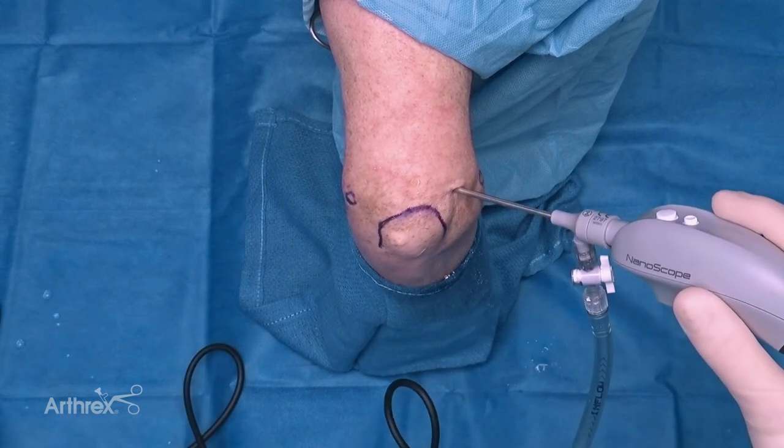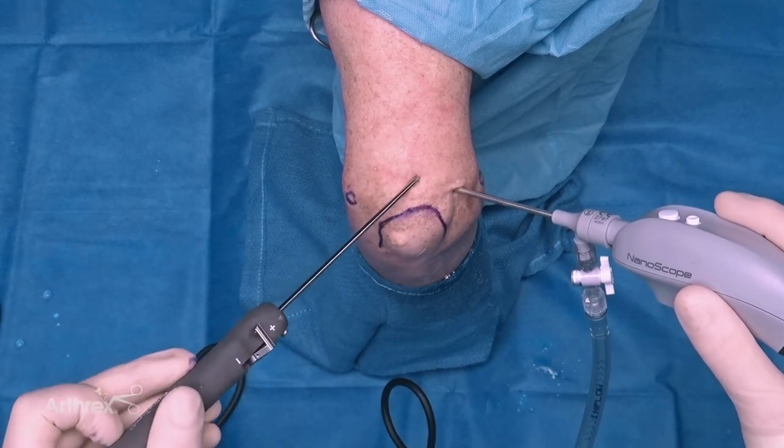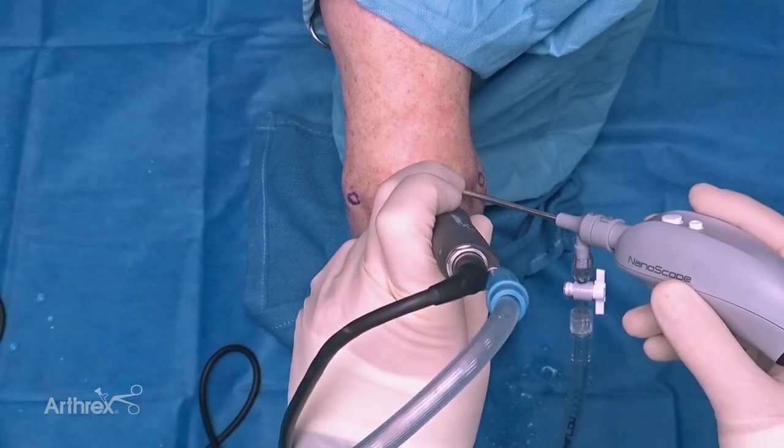Turn our water on. Next we're going to bring our nano shaver into the trans tricep portal I created previously. This nanoscope saber shaver is 2.8 millimeters in diameter by 11 centimeters in length, on the smaller more ergonomic shaver handle. As we can see, this is a relatively degenerative elbow - probably more so than the typical elbow you'll be scoping in your practice - so there's quite a bit of chondrocalcinosis, or maybe this patient had multiple corticosteroid injections, so we're really going to put this 2.8 millimeter shaver to the test.